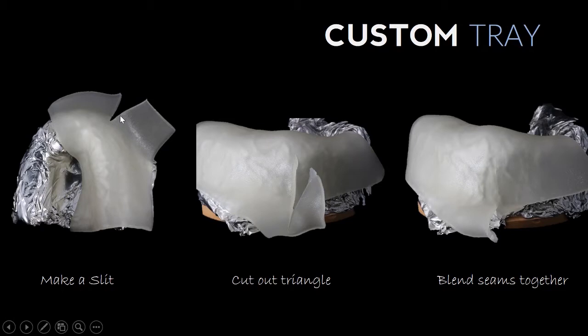So in doing so, when you're making this adaptation, once you get to this curved area where the arch starts to curve, you're going to want to make a slit in there and then overlap the material.